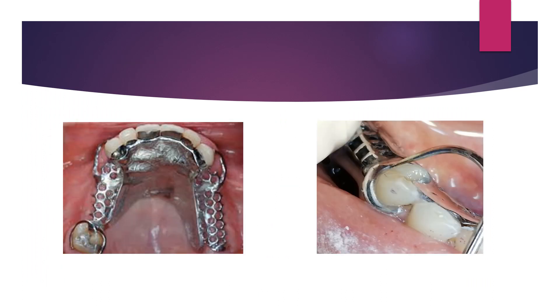After confirming the design and checking the framework fit on the cast, begin the try-in. Seat the framework and using a mirror and probe, check for close adaptation of the rests, clasp arms, proximal plates, and major connector against the teeth. The framework must be retentive and resist rocking when alternating pressure on both sides on the rests or major connector.